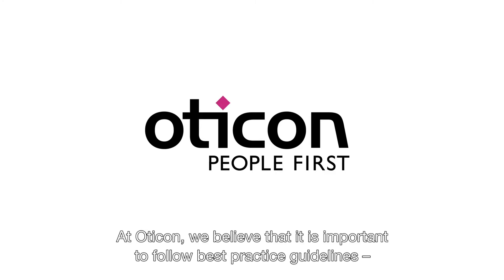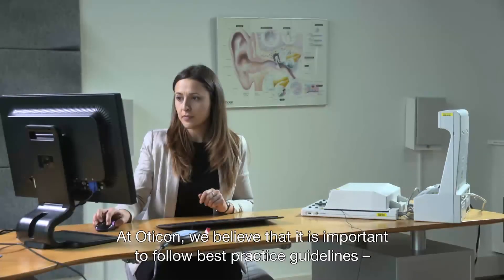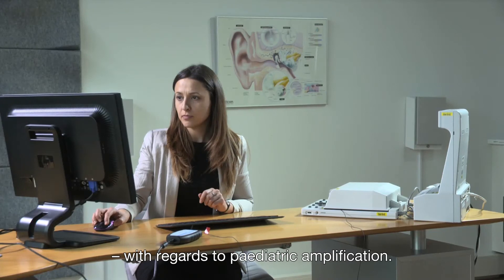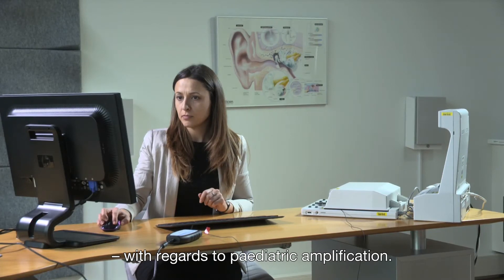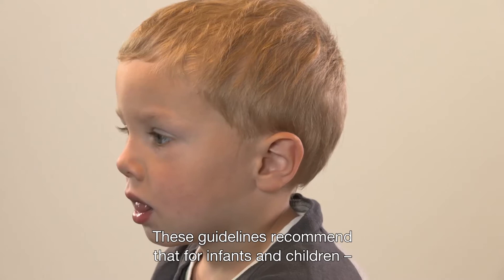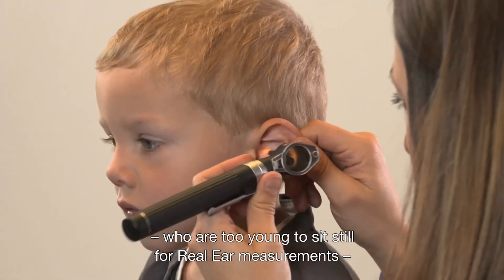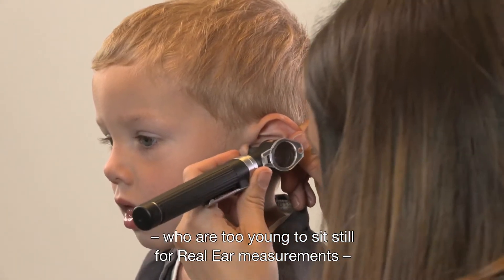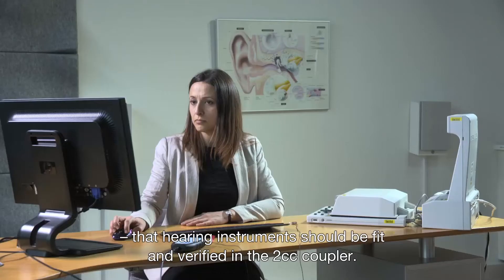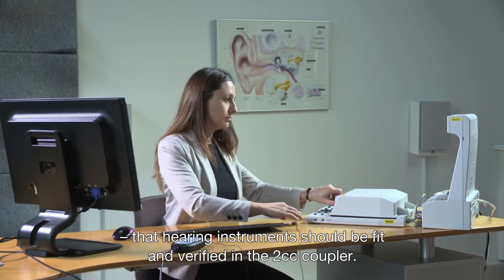At Oticon, we believe that it's important to follow best practice guidelines with regards to pediatric amplification. These guidelines recommend that for infants and children who are too young to sit still for real ear measurements, that hearing instruments should be fit and verified in the 2cc coupler.